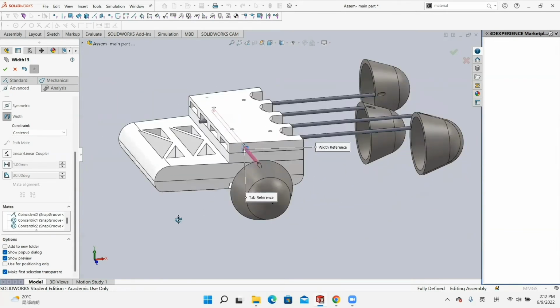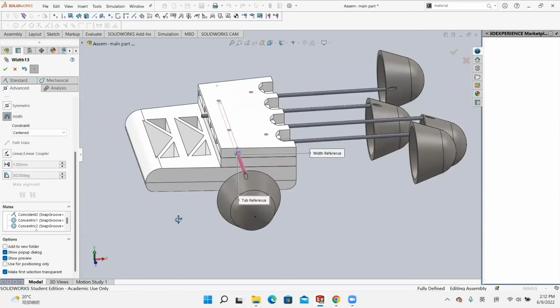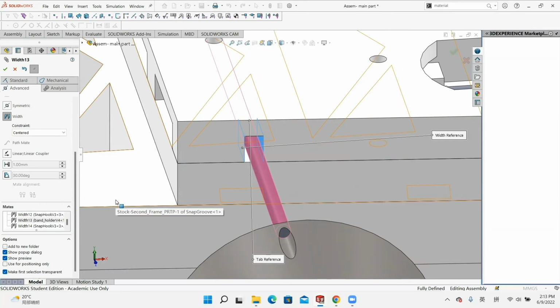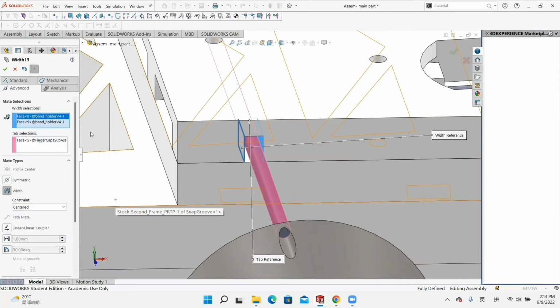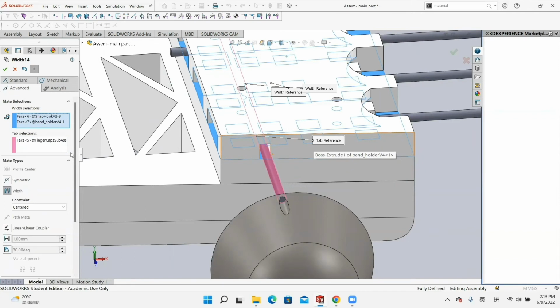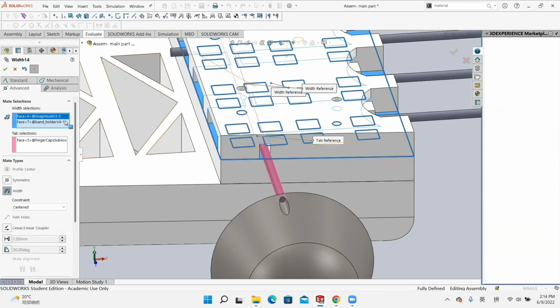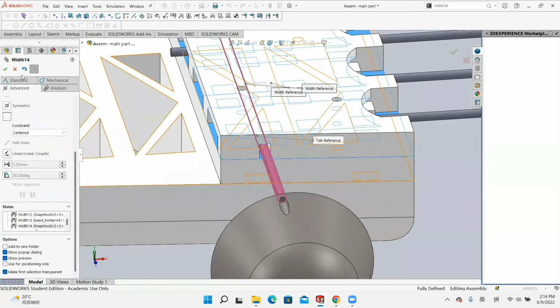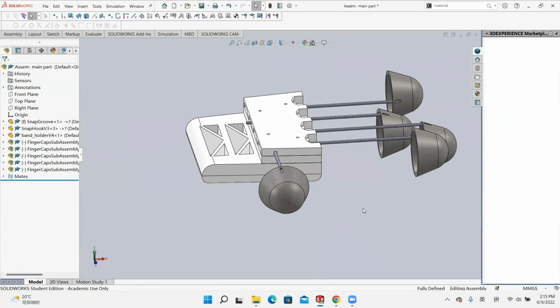For the thumb's elastic cord, it's a little bit different here, since we have measured the dimension of the hooks using one of our group members' hand, Eli's hand, and for the thumb, we can simply choose the gaps which the band holder leaves for the thumb's elastic cord, choosing the opposite faces of the gaps here and tab selection the elastic cord, and do the same to let the elastic cord centered in the gaps of this displays. We choose the top face of the snap hooks and inner bottom face of the band holder. Tab selection the elastic cord. That's it for the main part. And it should be all fully defined here.